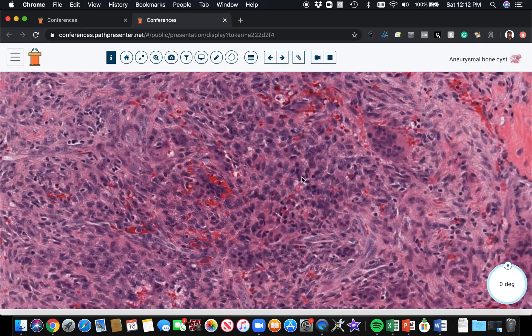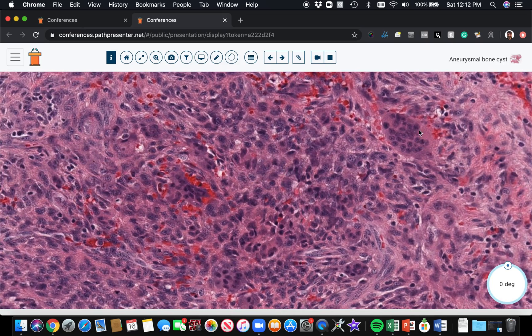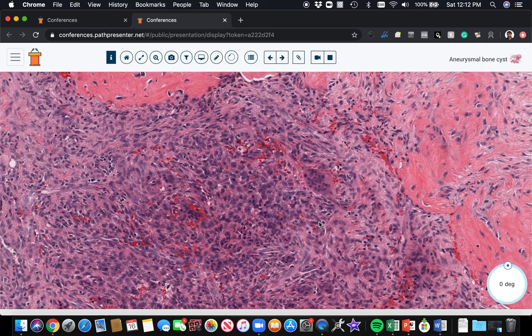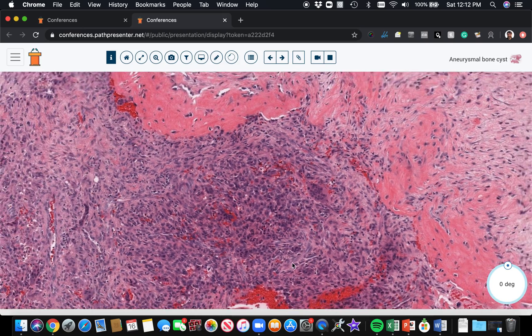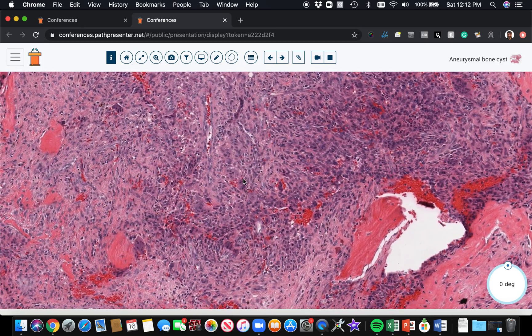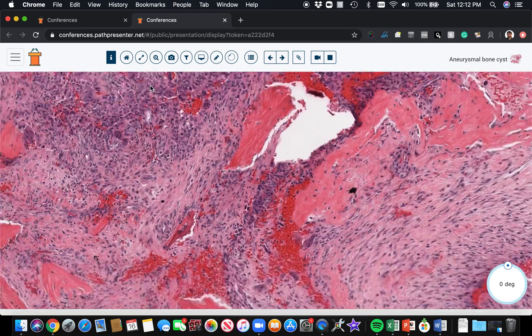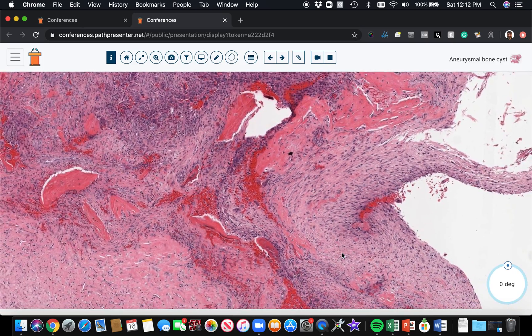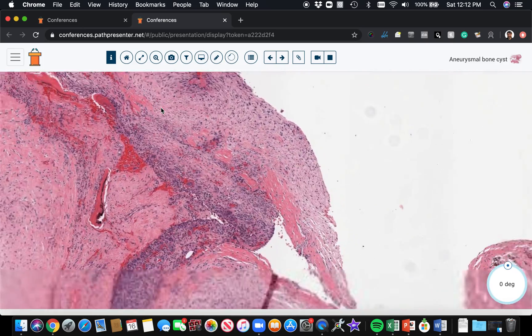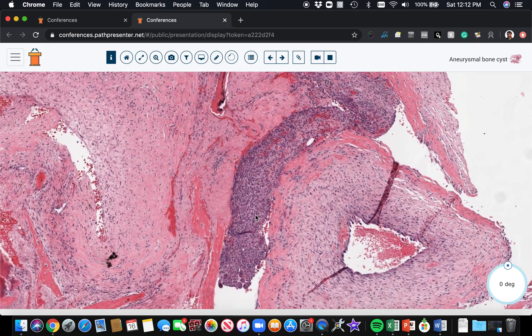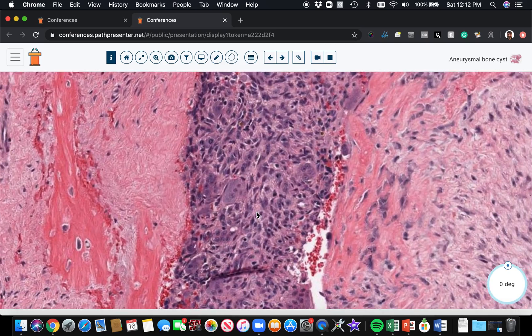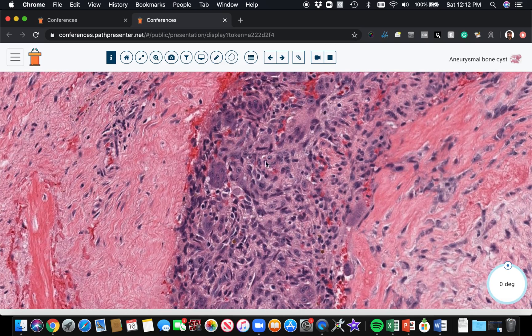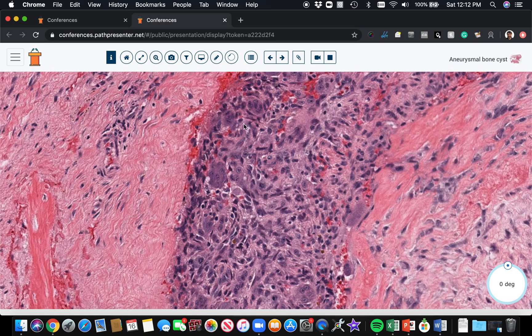So nice example of the lining of the cyst, but look at these cellular areas here. You tend to have pockets of cellularity with large osteoclastic giant cells. So you can have areas that are giant cell-rich in an aneurysmal bone cyst.